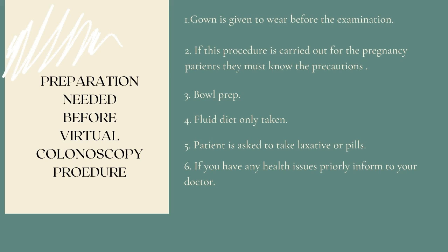Next, we are going to see about the preparation needed before the procedure. The patient should wear comfortable loose clothing to the examination. They are given a gown to wear before the procedure. If a pregnant woman is having an examination, they should inform the CT technician so that safety precautions are taken before the procedure. The bowel cleaning procedure is the same as that of colonoscopy and consists of the same cleansing liquid. It is very important to take a liquid diet before the procedure, and also it is very important to clean your colon the night before the colonoscopy.